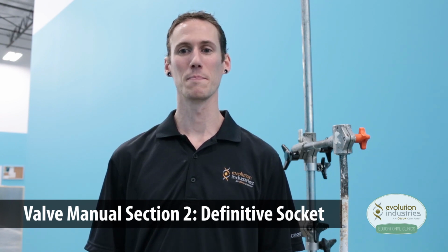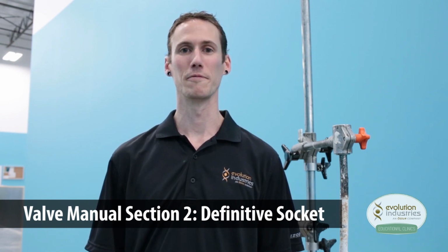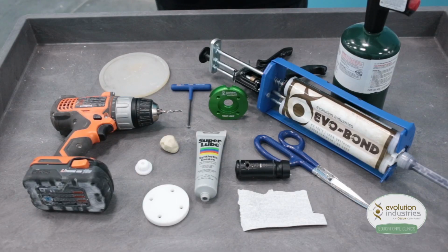We will make a check socket and a definitive socket with the VMP007 valve plate from Evolution. From there, you will be able to install any one of our component configurations. And now we will fabricate a definitive socket using Evolution's VMP007 valve plate. Here are some of the tools that we will be using to fabricate this socket.